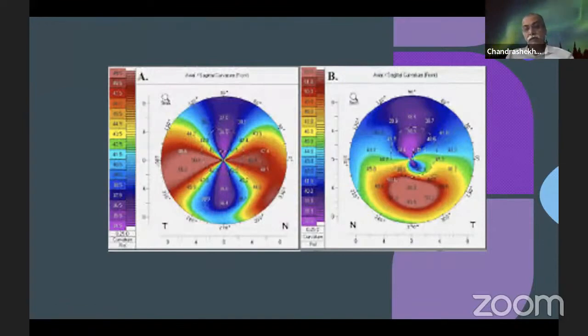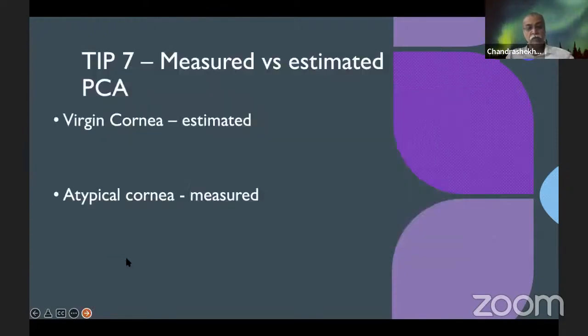And going a little further, corneal ectasia, whether it is keratoconus, post CXL or post LASIK ectasia, we grade them according to topography. But there is a new classification available, the Retics classification, which takes into account Q value, best corrected visual acuity, cylinder amount, and high order aberrations, etc. And that works very well. When according to the Retics classification the patient has got grade 1 or maximum grade 2 keratoconus or ectasia, that is the time toric IOL is going to work the best. And as you go more and more into the grades, the toric IOL is likely to give you more and more surprise.